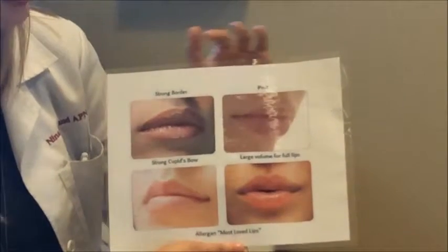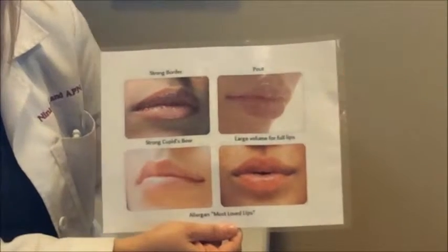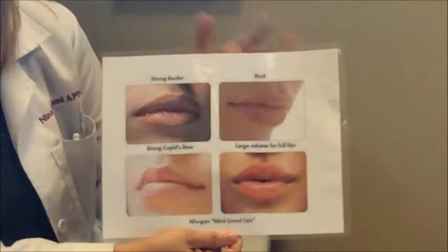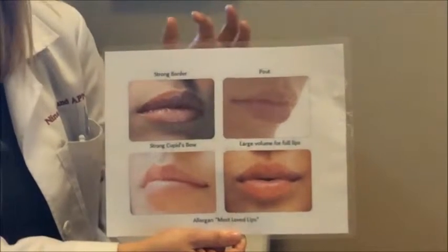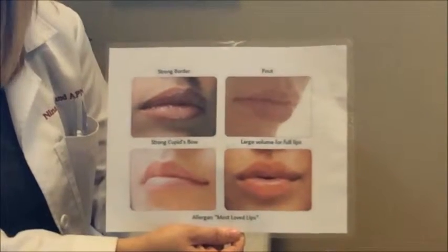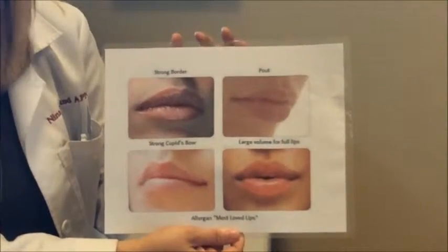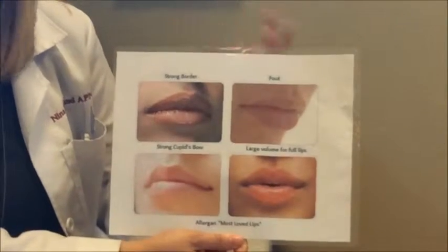So that's really nice. Another thing that we do a lot is the pout, and so proportions of the lips are really important. You know, the proportions of the face are important to keep intact so that you still look natural after you've had your filler procedures. And in the lips, what we try to do is keep the top lip smaller than the bottom lip. So when you think of a ducky lip or duck lips, that's a really unnatural look, and that's usually when this top lip gets way too big.